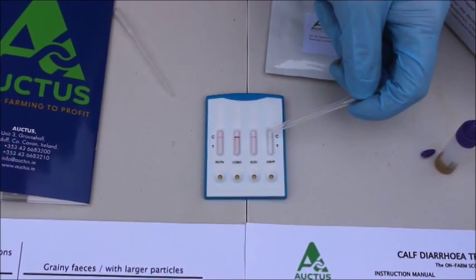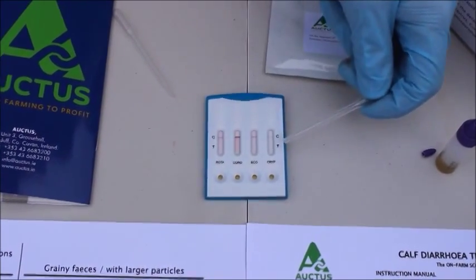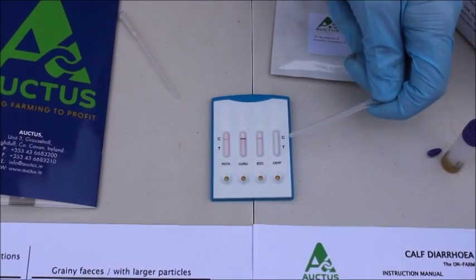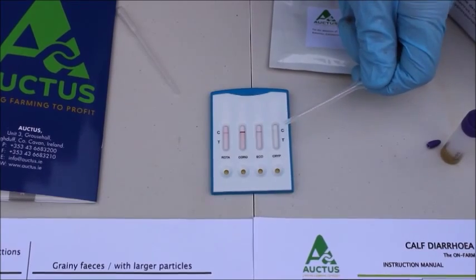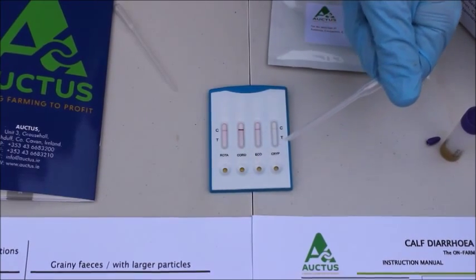We can see here that the control line on each particular test indicates the test is working. Along the test line for rotavirus, coronavirus, E. coli, and cryptosporidium, no line is present on any one, therefore indicating that the faecal sample is free from any bacterial or pathogenic organism of rota, corona, E. coli, or cryptosporidium.